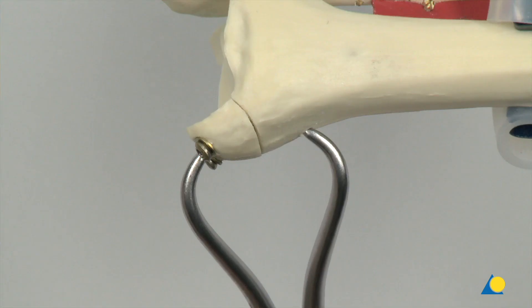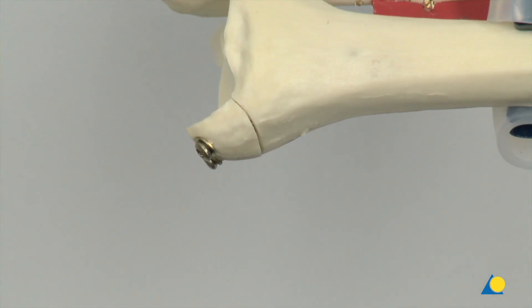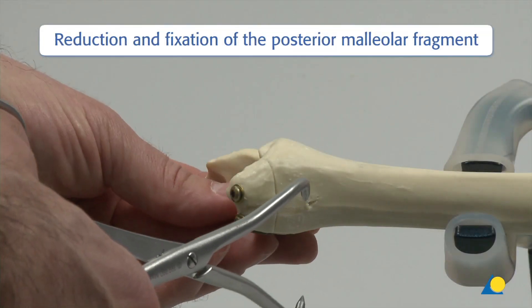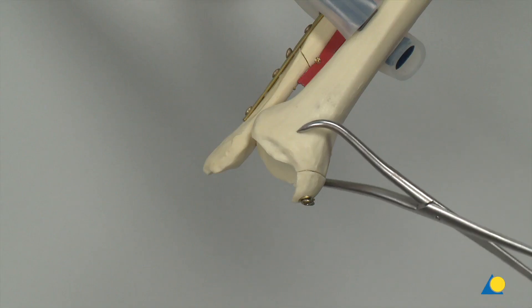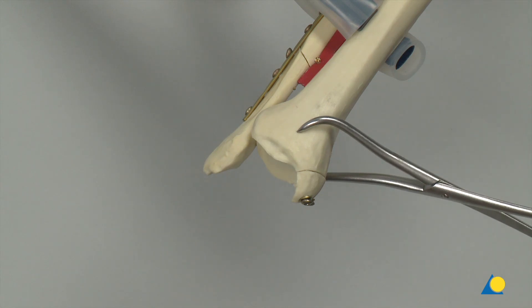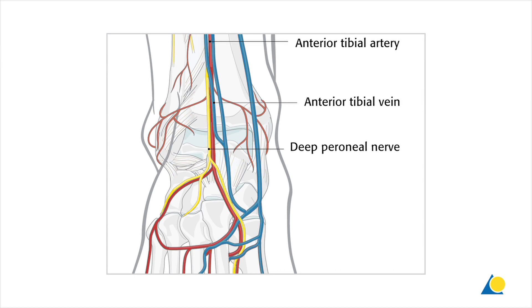The next step is the reduction and screw fixation of the posterior maleolar fragment from anterior. Clinically, it is important to allow visualization of the tibia in order to avoid damaging soft tissue and neurovascular bundles during drilling and screw placement. A stab incision is made anteromedial in order to be perpendicular to the fracture of the posterior maleolus, and L-shaped retractors are placed to gain visibility of the anterior tibia.